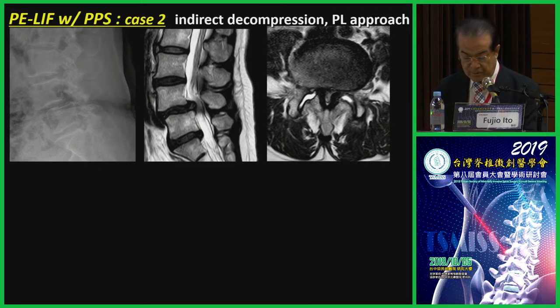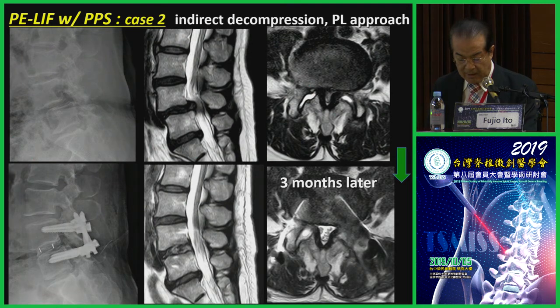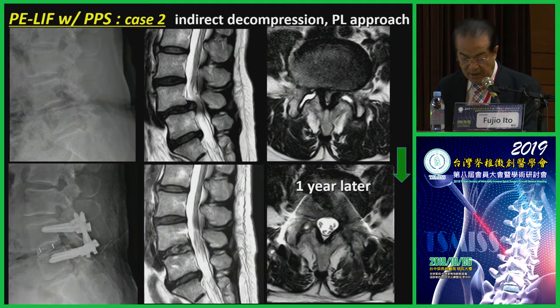PE-LIF case 2. Surgery time was 2.5 hours. Blood loss was 30 milliliters. X-ray after surgery showed good alignment at L4-5. The PPS system and cage were placed in a good position. In MRI axial view, the spinal canal was moderately enlarged without direct decompression 3 months later. 1 year later, the spinal canal expanded further.